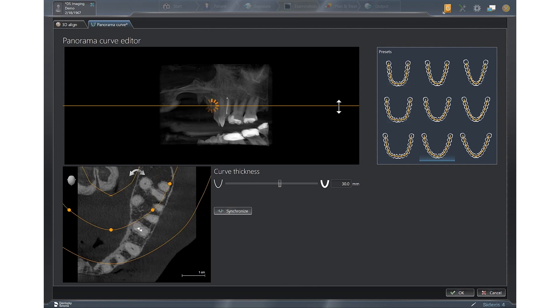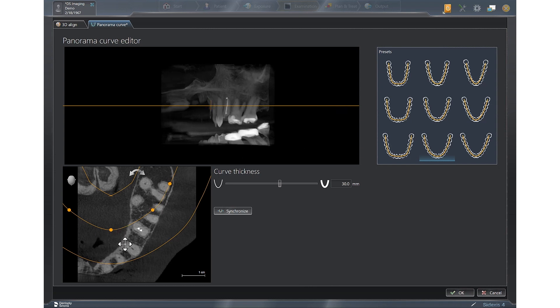You do not need to move the orange line as you did previously because as you can see in the arch form, you can see the entire arch. You also are going to leave the curve thickness where it is.